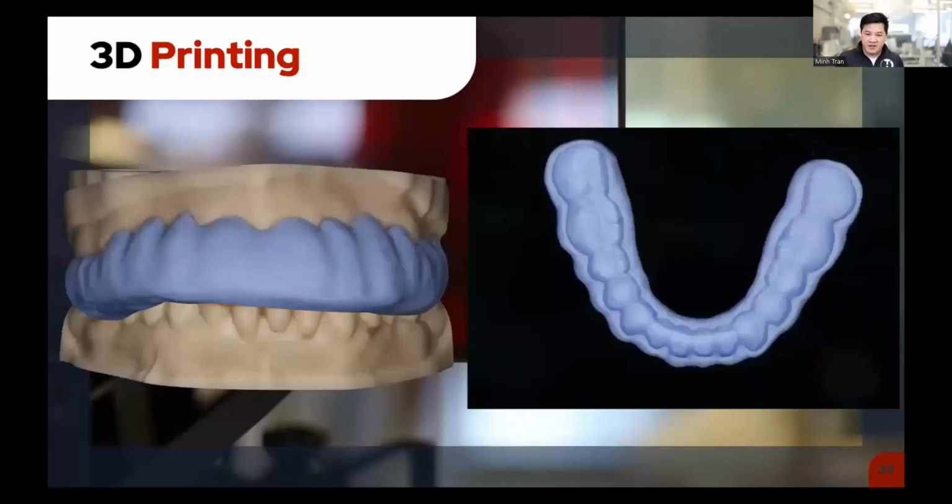Yeah, and even if you look at the composite mock-up, it's not perfect. There's a little bubble in there. The margins aren't fully sealed or anything like that. But it gives you such an instant appreciation for where it's headed, right? Yeah, that's phenomenal.